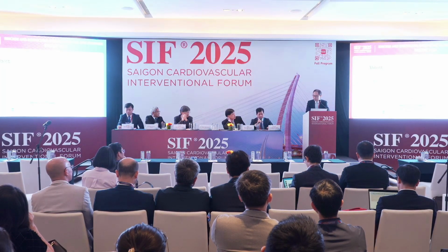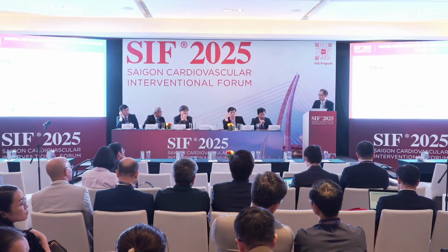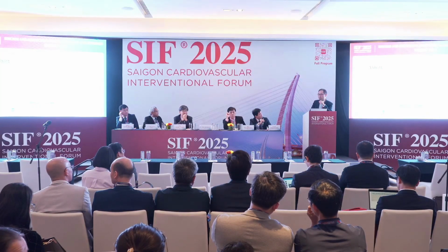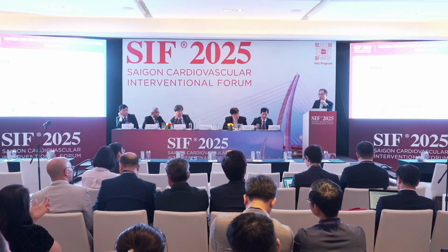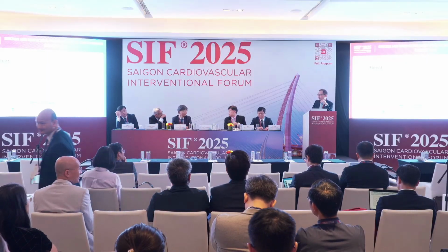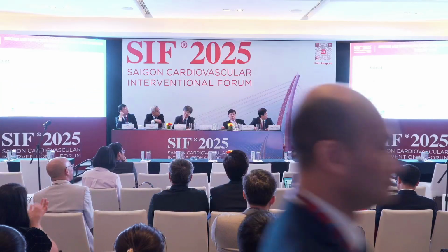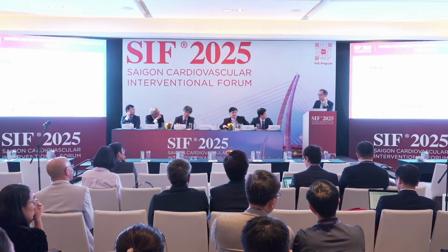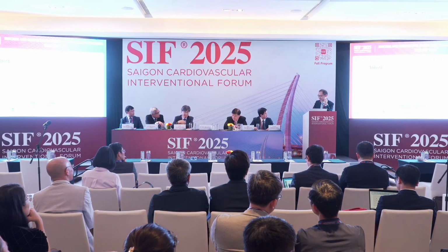Yeah, for the first case, did you try the non-compliant balloon or cutting balloon first before you use the rotablator? Yes, we did. In fact, we tried to just even get a 1.5 balloon through. It wouldn't even cross. So it was very tight in the proximal segment. So that's the reason why in the end we just had to. Well, I was hoping that we didn't have to rotablate the circ actually.